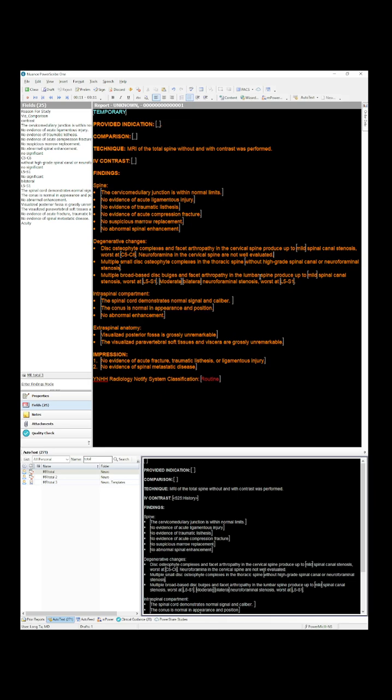I basically just try to describe the worst areas, or the areas that are sufficiently bad or that correspond with patient symptomatology, that are explanatory, actionable, or meaningful. I try to minimize talking about things that are not that important, especially if we're in an acute setting.